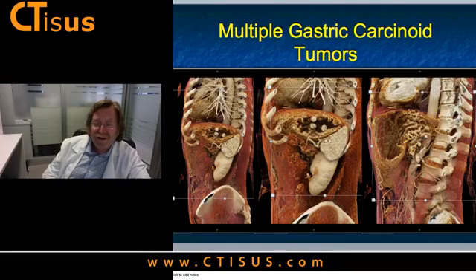Well, you have to look at the video and you can see, but I don't think we're going to do Facebook Live on my workstation, to be quite frank. You just have to come to the meeting. You can sit there and play with it yourself, and you can see firsthand how good the interactivity is.